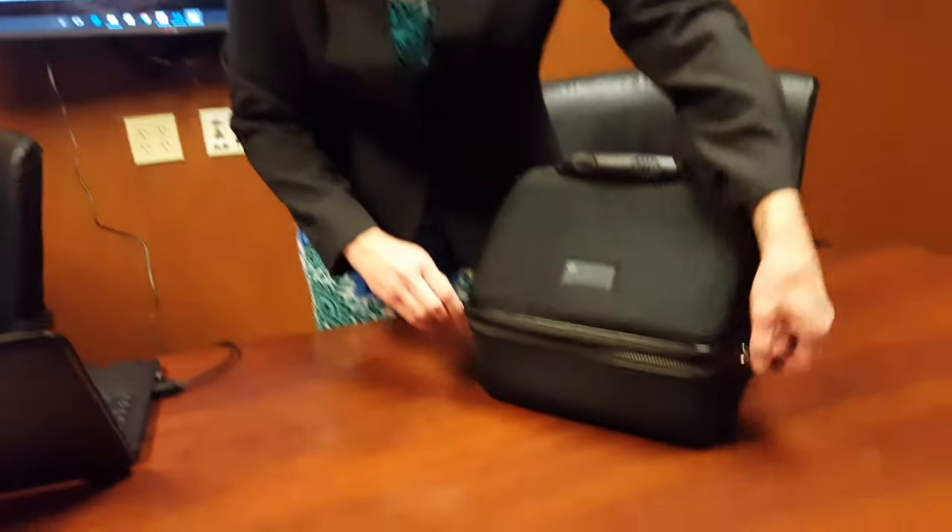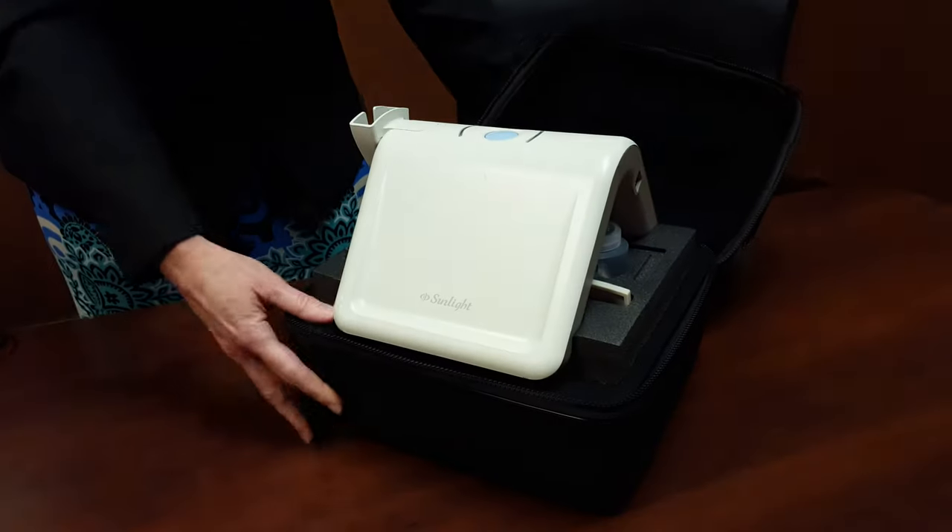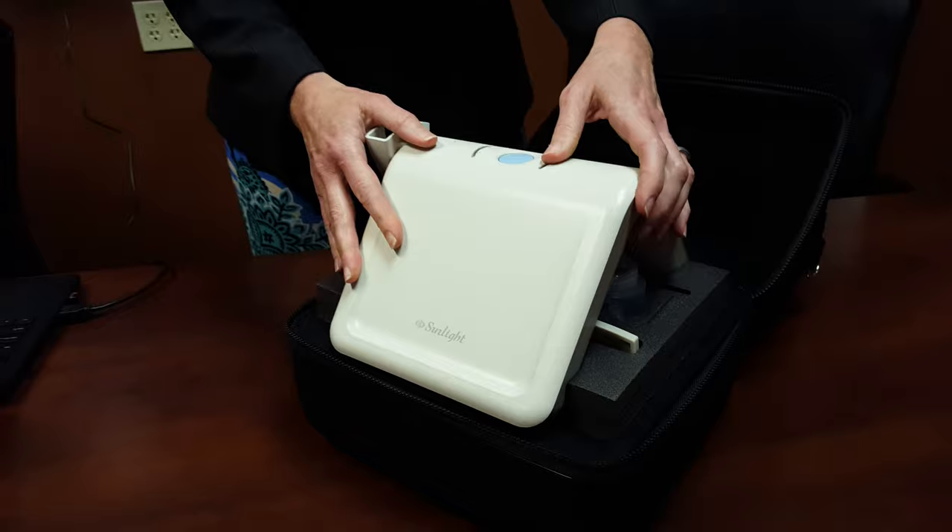This is Tamara with BeMed to show you how to unbox your new Mini Omni Portable Bone Density Scanner. Here it is. Simply unzip the black case and you'll see the main unit here.